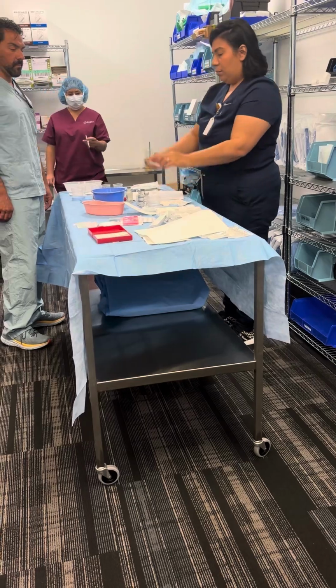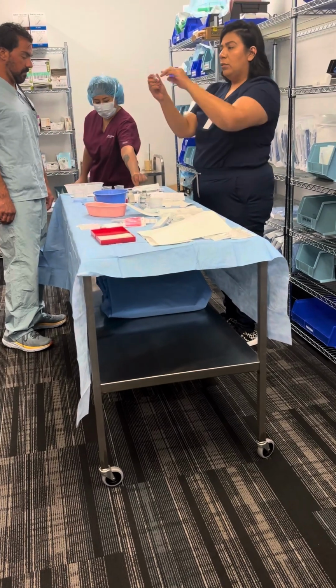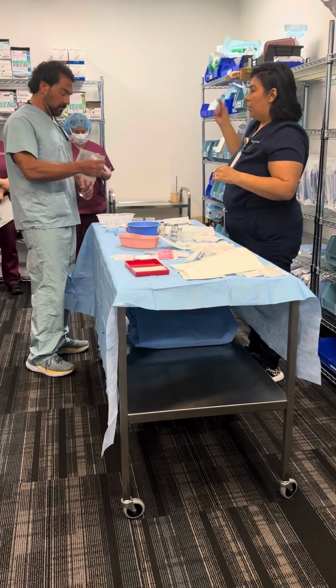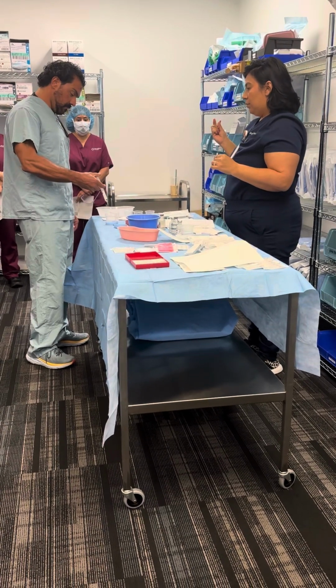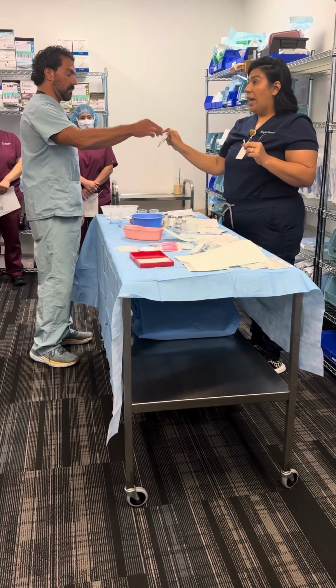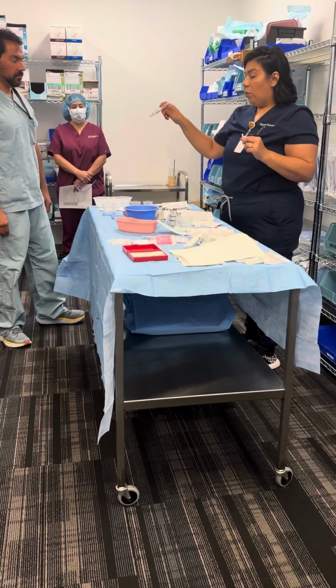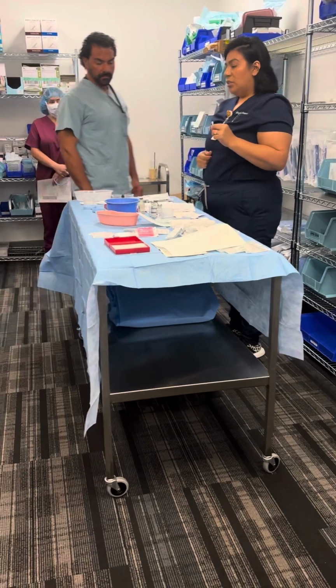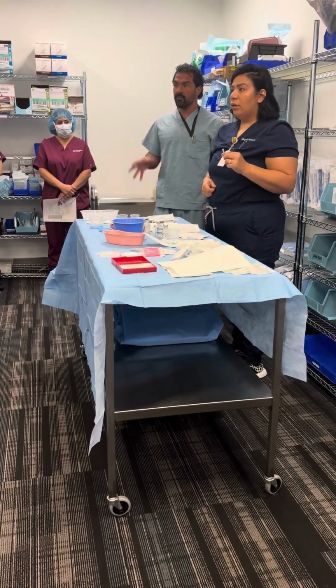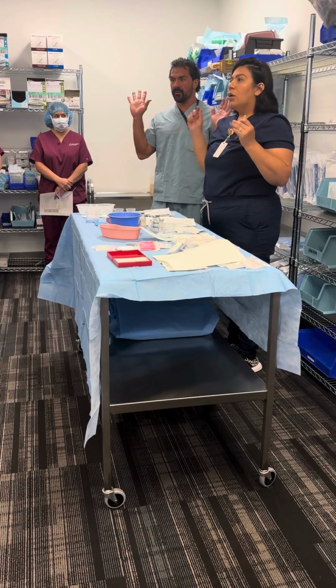Okay. Pencil, remember, pencil, cap off, injects. He's going to inject however much. He can either give it back to you or he can put it down. Most of the time, that's what you're gonna get at the Mayo stand. So don't try to reach for it. Just let the doctor put it down.